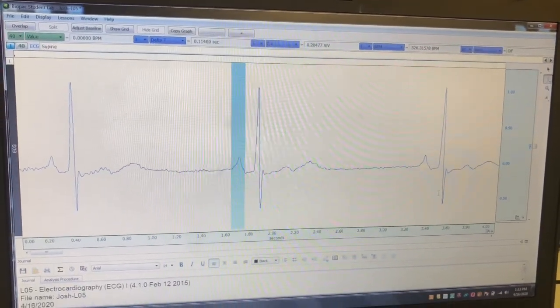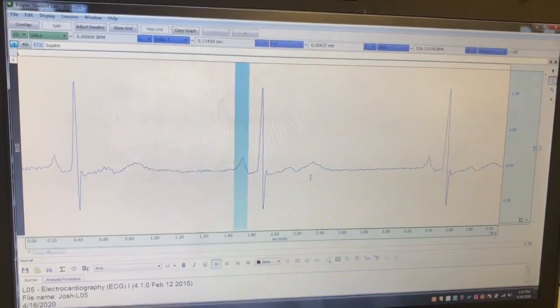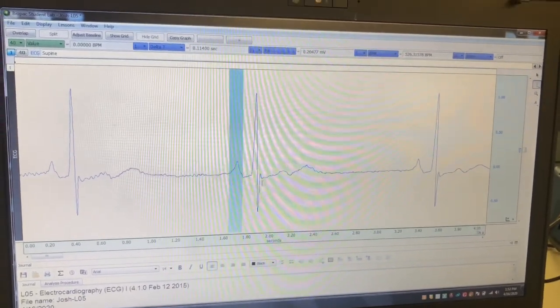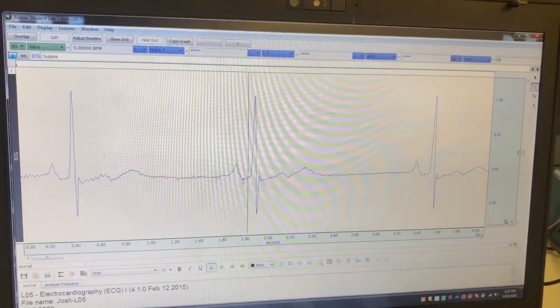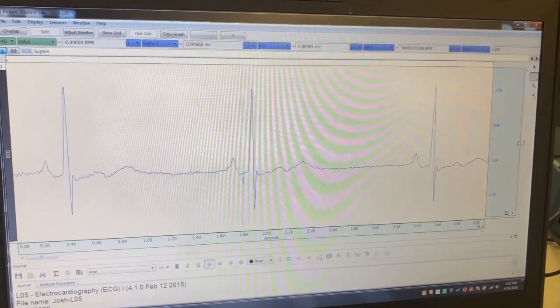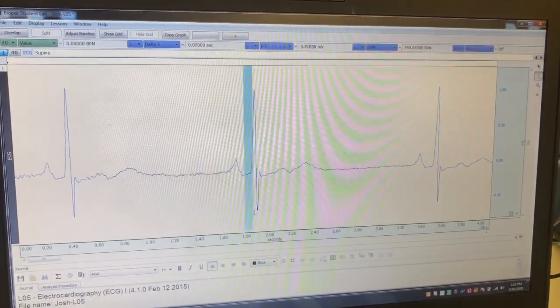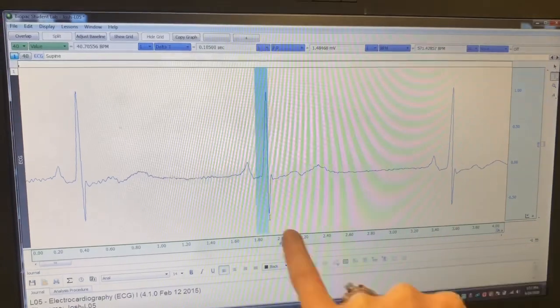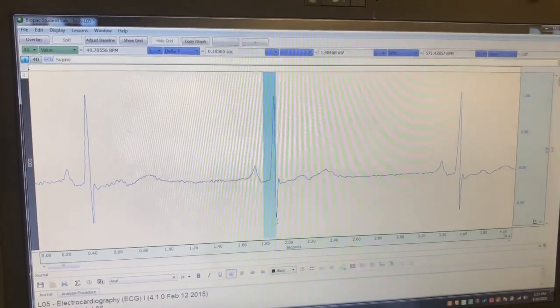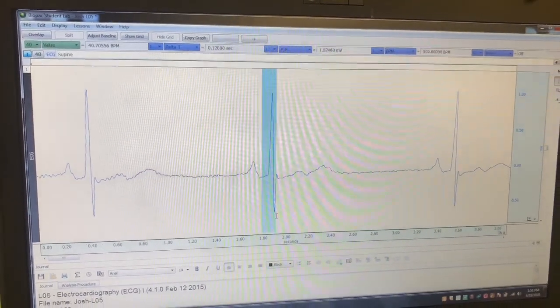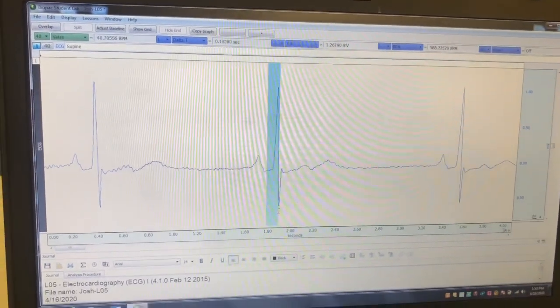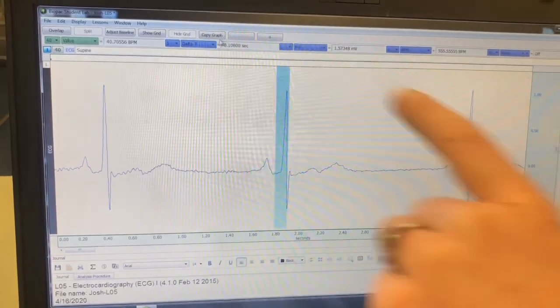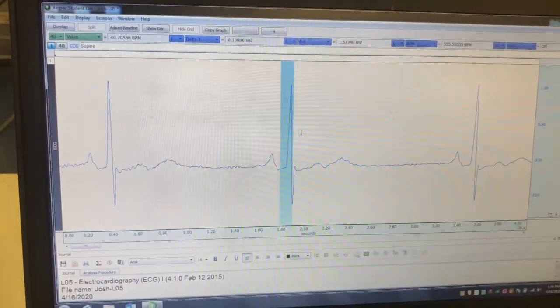The next thing you're going to do is the QRS wave. You're going to find that Q wave and go to the bottom of the QRS wave. Right here is the bottom of that S wave — it's going to be a little hard to get exactly right, so just try your best. That gives you your time and your amplitude.